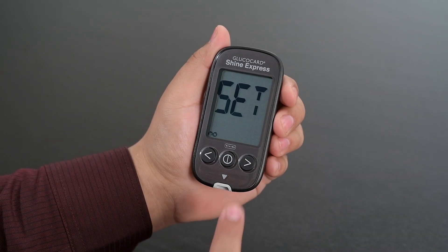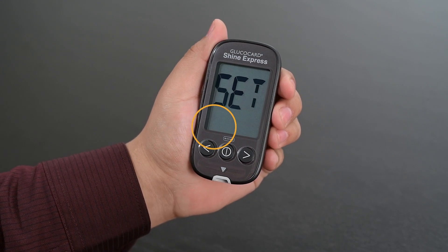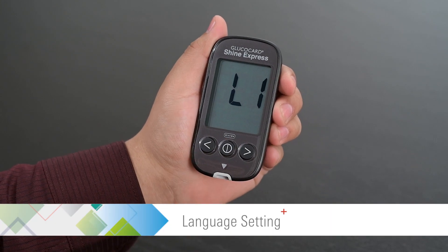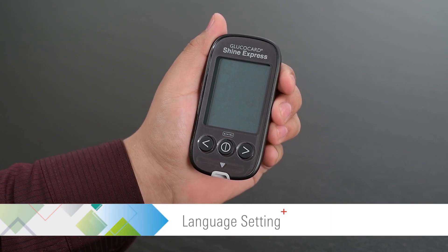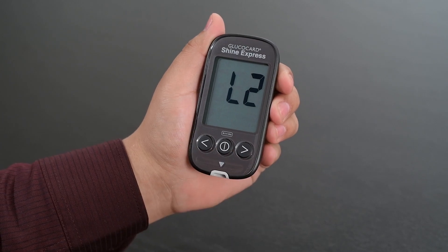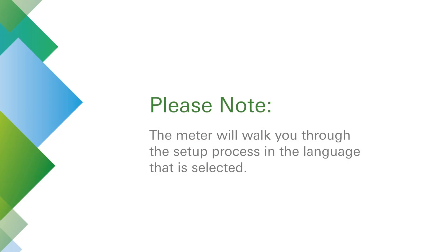Now press the left or right arrow button until 'Yes' appears on the screen. Press the center button to enter the language setting. Use the left or right arrow buttons to select L1 for English or L2 for Spanish. The meter will walk you through the setup process in the language that is selected.